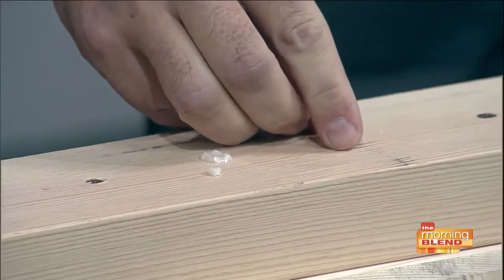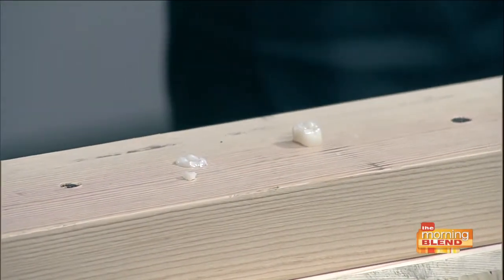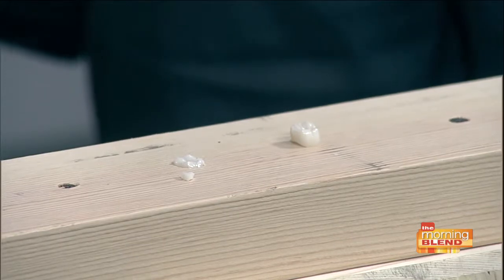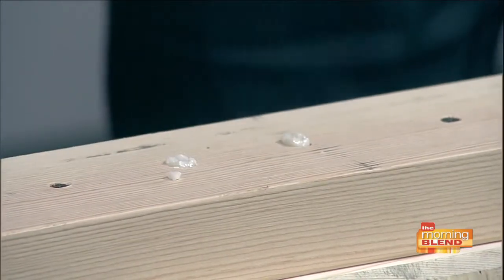That's one that would be representative, one that would be milled out in the office, whereas this is demonstrating, hopefully live television, hopefully don't get burned here. So here we go. This is the zirconia. There you go.